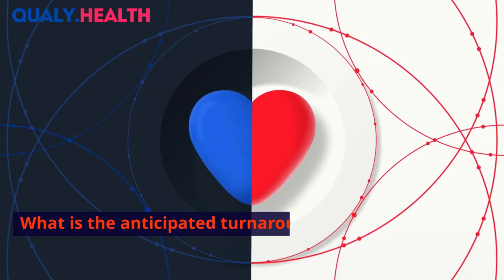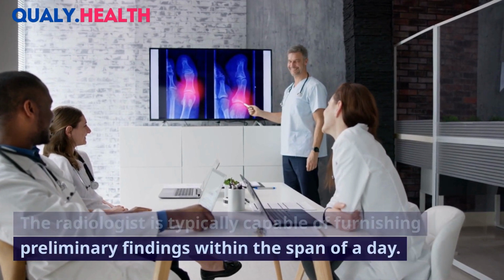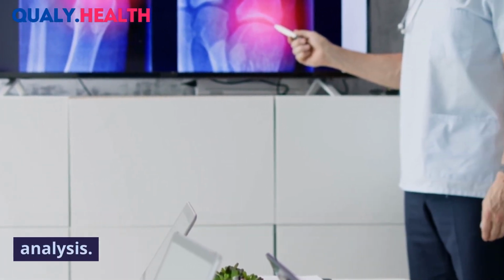What is the anticipated turnaround time for receiving test results? The radiologist is typically capable of furnishing preliminary findings within the span of a day. The formal interpretation of your CT scan may necessitate an additional day for comprehensive analysis.